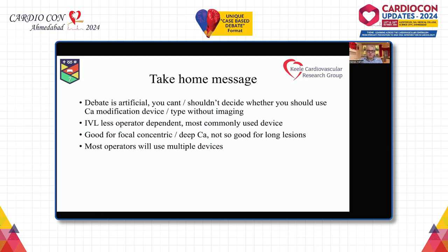Every case where you're thinking about using these devices, don't take them out, do imaging first, use the most appropriate device. I think IVL is less operator dependent. It's certainly the most commonly used device in several international registries. It's good for focal, concentric or deep calcium, not so good for long lesions. And I think that most experienced operators, and I'm sure my colleagues in this debate, will use multiple devices.